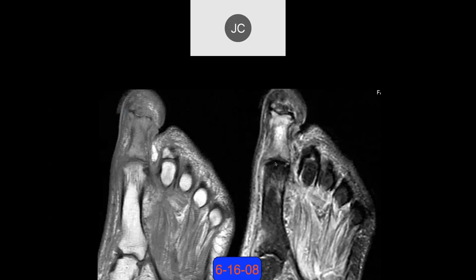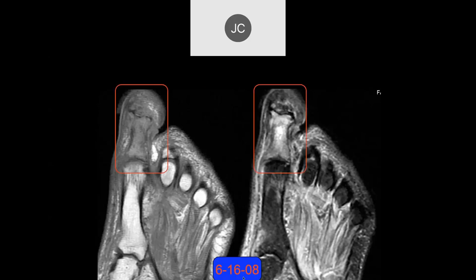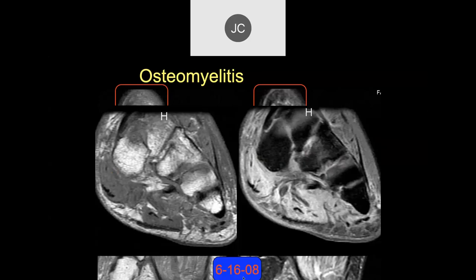Diffuse edema within the proximal first phalanx — maybe a little step-down here. This patient, from June 2008, was shown to have osteomyelitis. On the coronal images, the flexor tendons and muscles look pretty good at this time.